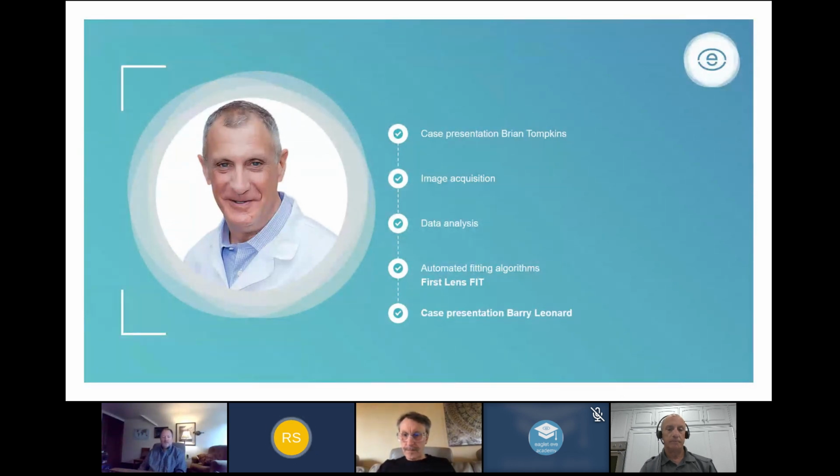For example, if you have a pinguecula rather far out, you can consider designing a very small lens to avoid the pinguecula. Another reason is a very extreme toric eye, where you want to go smaller as well because it's going to have less rocking. So we're not going to do this just based on the HVID. So far, we're not going to recommend the overall diameter.